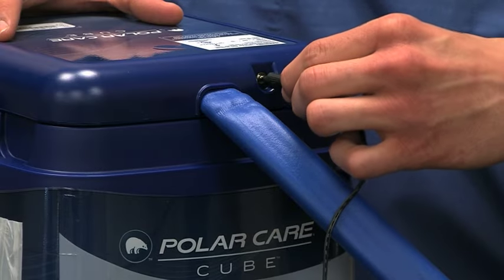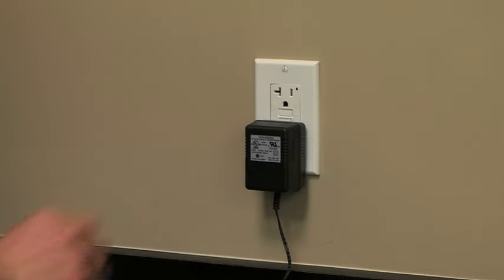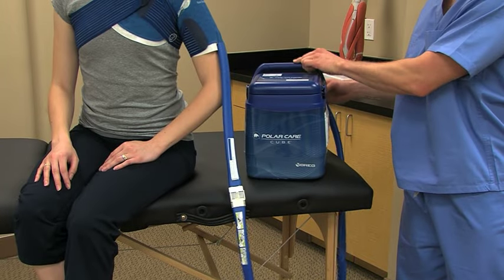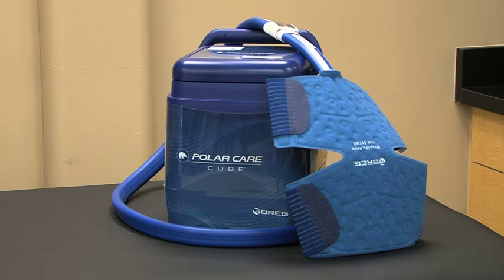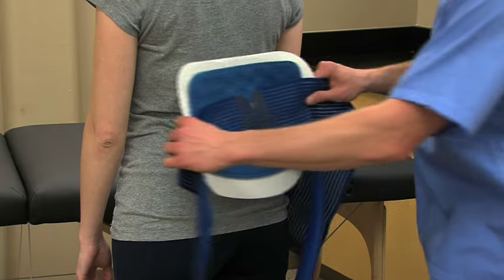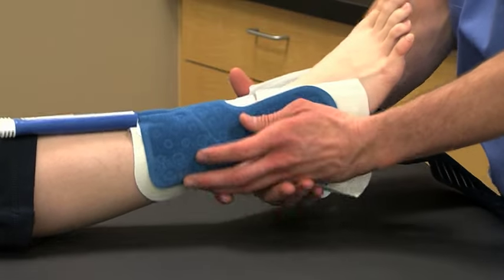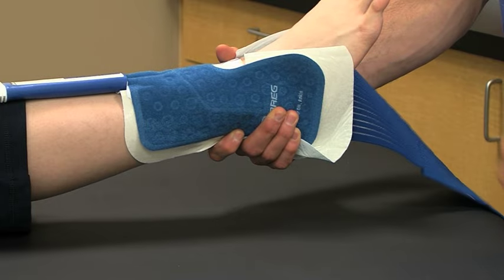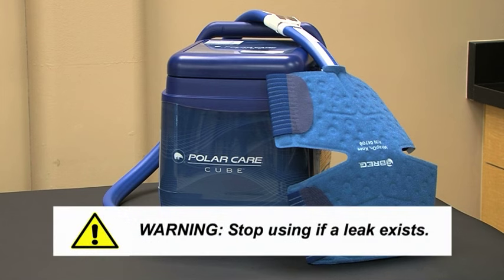Plug the power supply into the DC jack and plug the other end of the cord into a power outlet. Once it has power, the unit will immediately begin circulating water through the pad. The cube is extremely quiet, so you may not hear the pump unless you get close. The average surface temperature of the insulation barrier over the pad will be between 45 to 55 degrees Fahrenheit for pads intended for use on core body parts and 50 to 60 degrees Fahrenheit for pads intended for use on extremities. In the unlikely event water leaks from any part of the unit, pad, or connection, stop using the unit and contact your local Breg sales representative or Breg Customer Care.